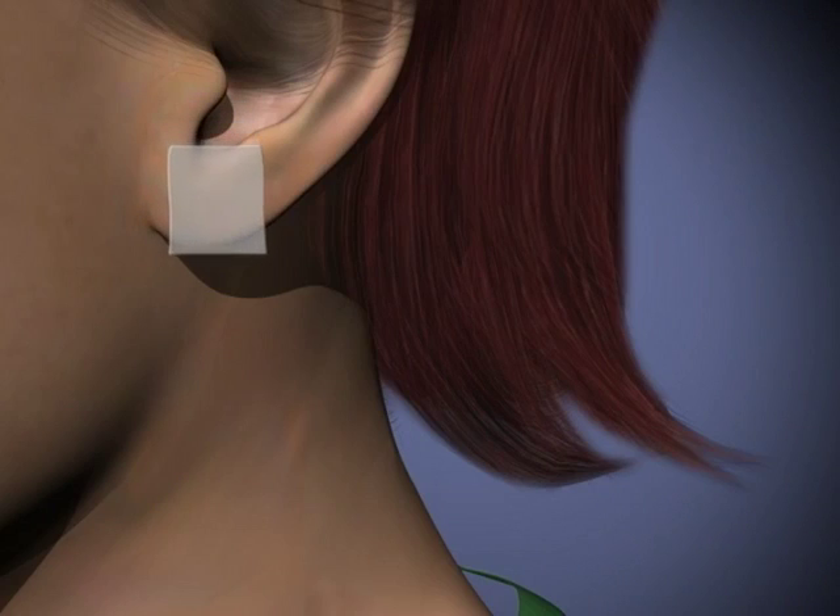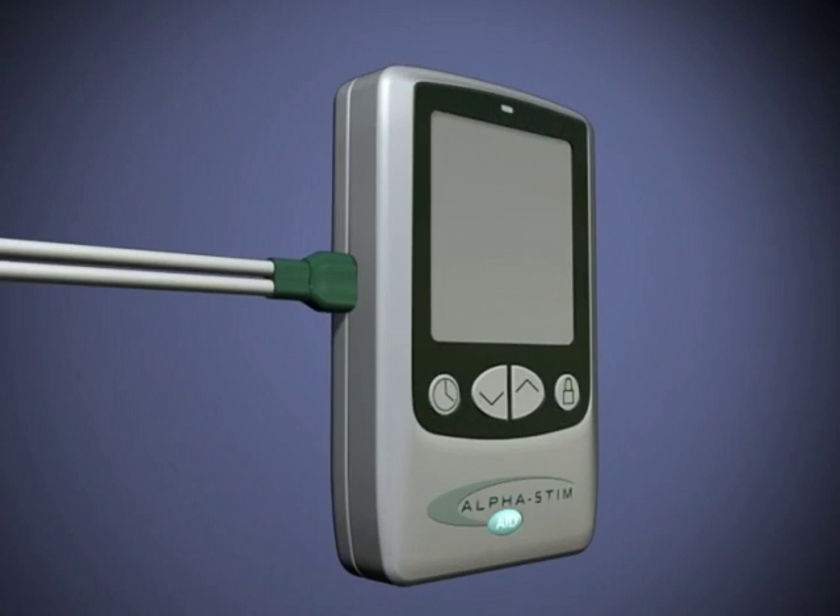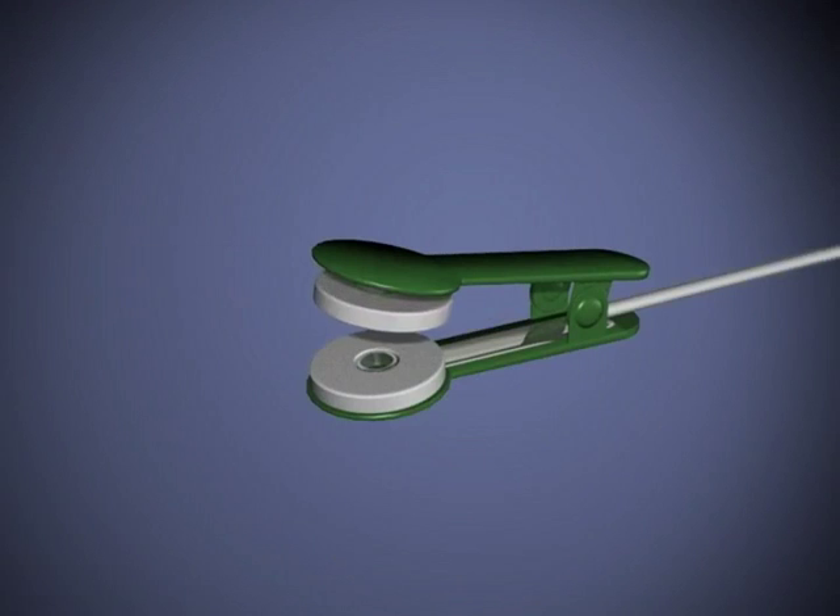Clean skin of ear lobes with mild soap and water or alcohol wipes and allow them to dry. Plug the dual connector end of ear clip wires into the jack. Remove old ear clip electrode pads if present, and attach four new ear clip electrode pads.